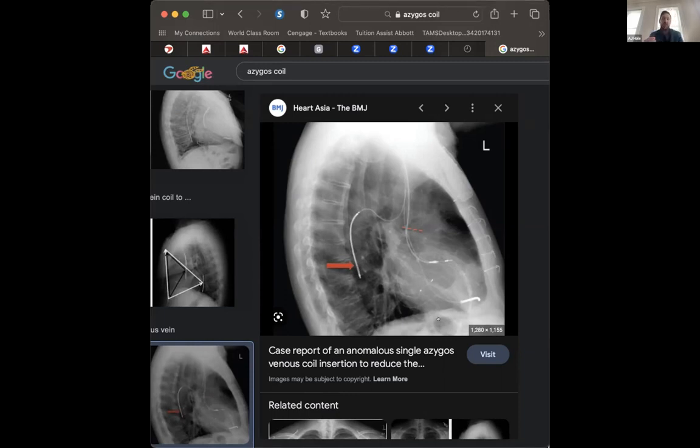So there are ways you can program within the device, and I can't really speak to the other manufacturers, but within Abbott, we can play with the biphasic waveform and how long you give each phase. So you can try to cater that to the patient, which is what we call DEFT, D-E-F-T, within Abbott. Other companies have some degree of programmability that I'll let someone else talk about. And then there's also the ability to add hardware. This is obviously a little more invasive. So if we can program it within the device first, that's ideal.